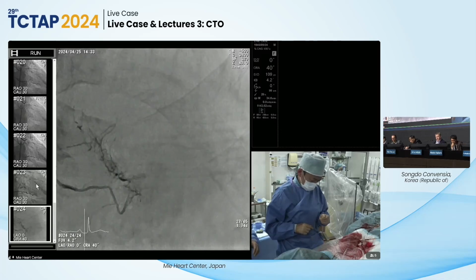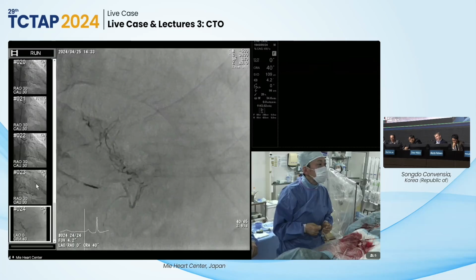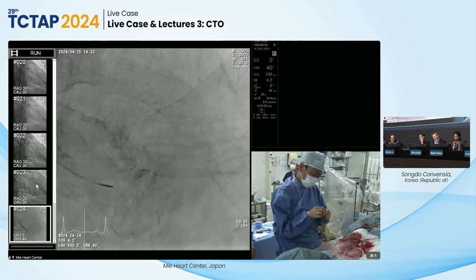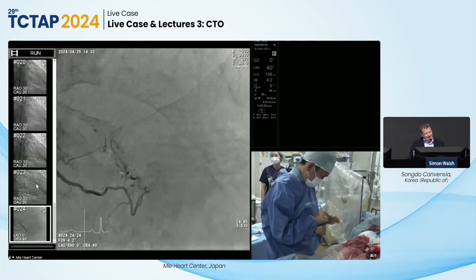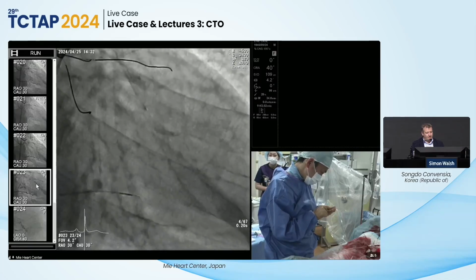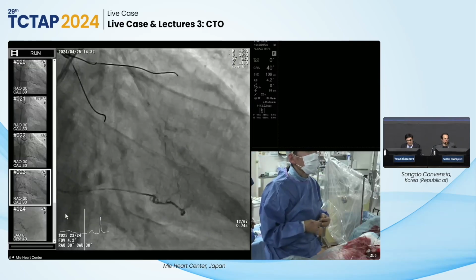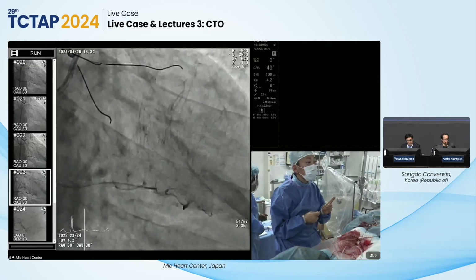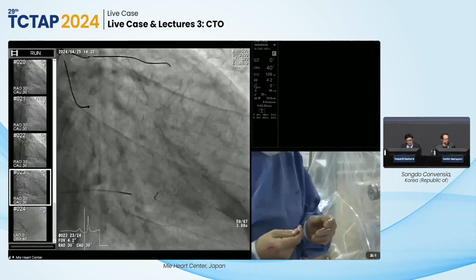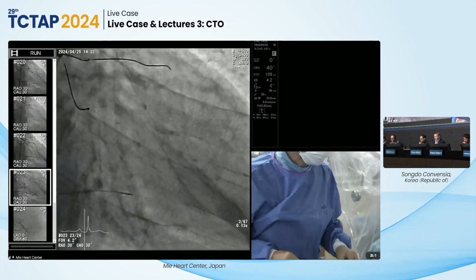Maybe the most distal one is also good, eh? Can you try the most distal, and it's also a strong one. I don't think it will rupture, huh? Yeah, the proximal one looks promising there. The one that's just off the screen. Those distal ones have also always a big bending, and therefore we are a little bit more conservative, but it's a strong one there. So I think it would also be possible. I think the more proximal we go, sometimes you get too close to the cap, or related to the CTO body. So you have to understand where the collateral is going to end as well.